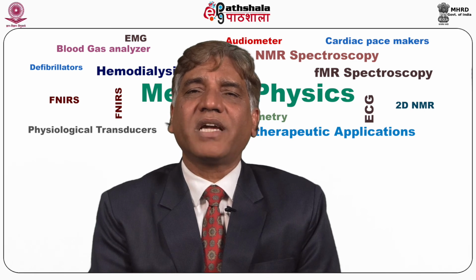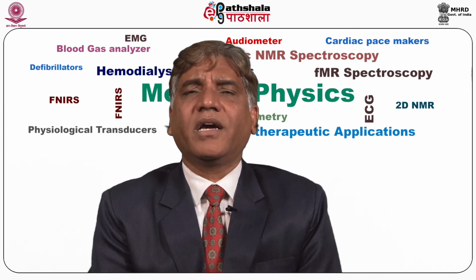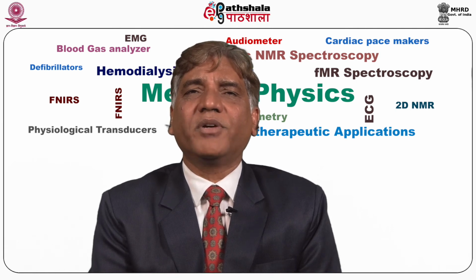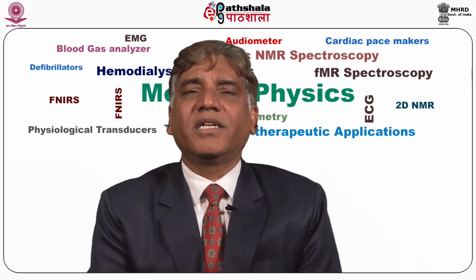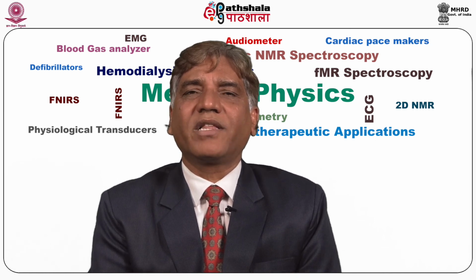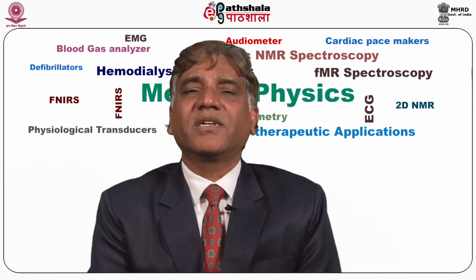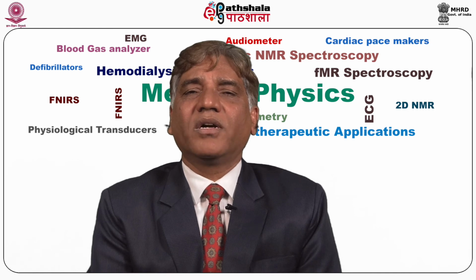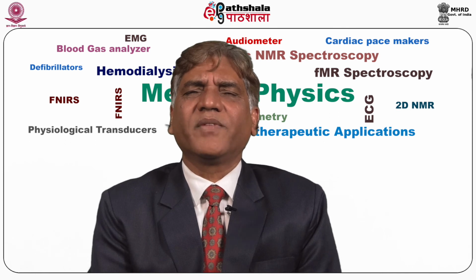Here what STIR means is that the time of inversion is very short. For example, if I want to suppress the fat from the image, I'll use the STIR pulse sequence. In STIR, the time of inversion is usually 0.693 of T1. For example, in the case of fat, this time is roughly 250 times 0.69, something about 180 millisecond.